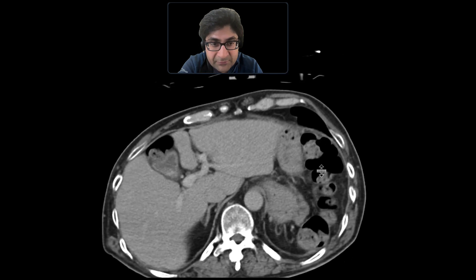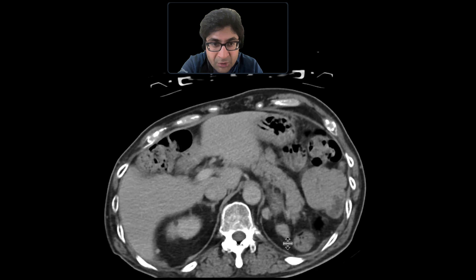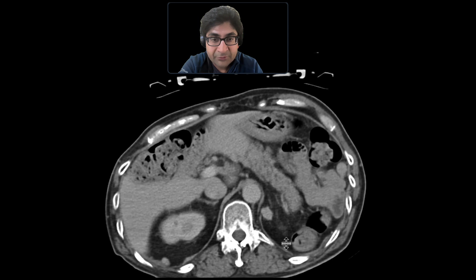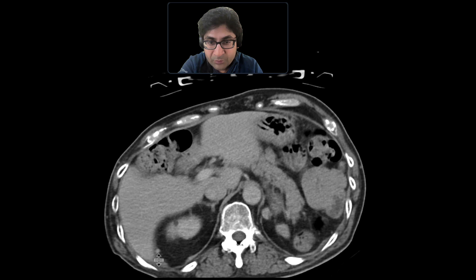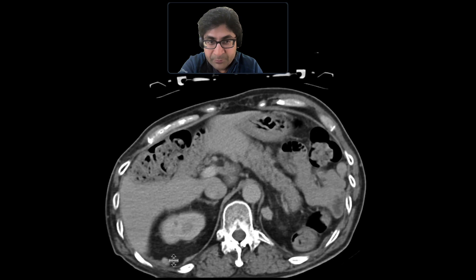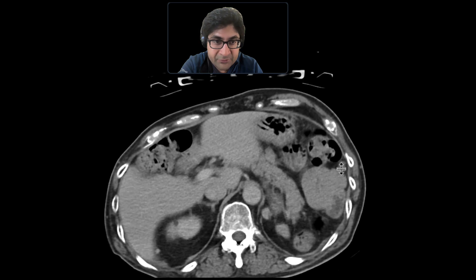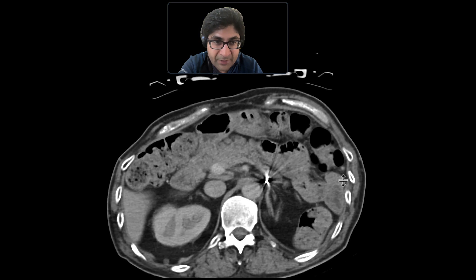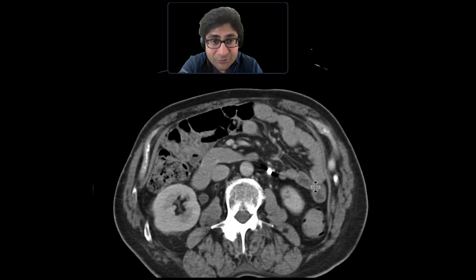If you look in the left upper quadrant, there are these two nodules here, but there are also similar appearing nodules on the right side — one smaller one there, one bigger one there. And as you look here adjacent to the bowel loops, there's another roundish appearing solid nodule.